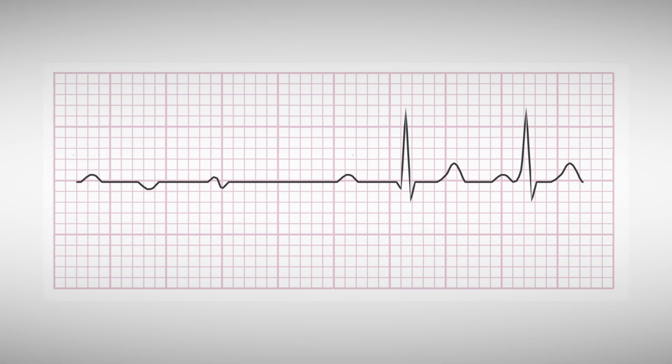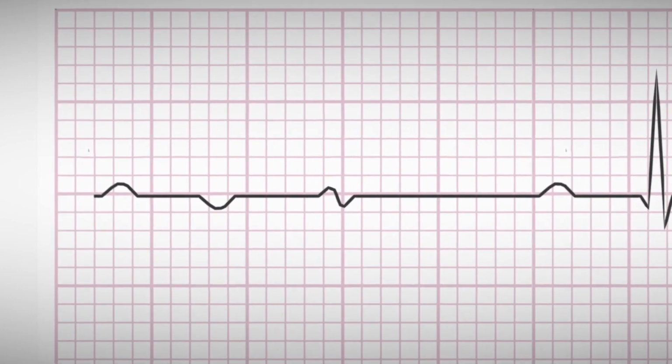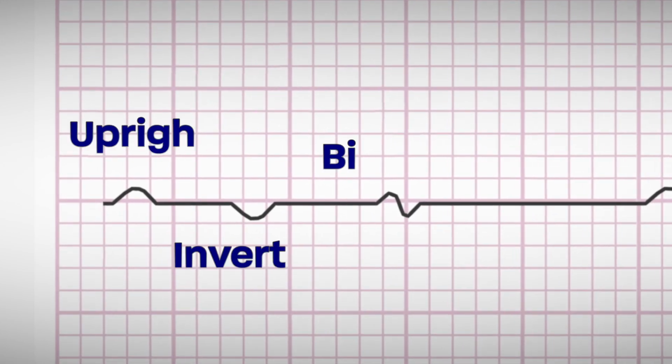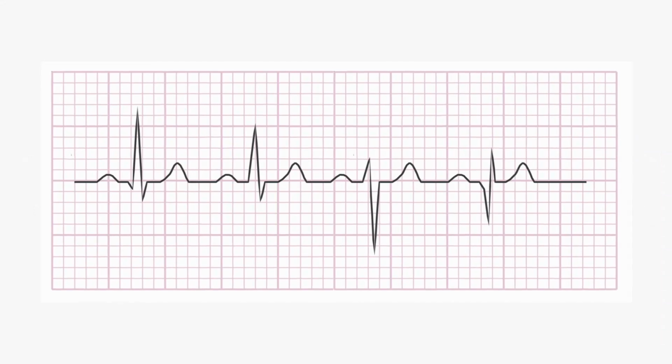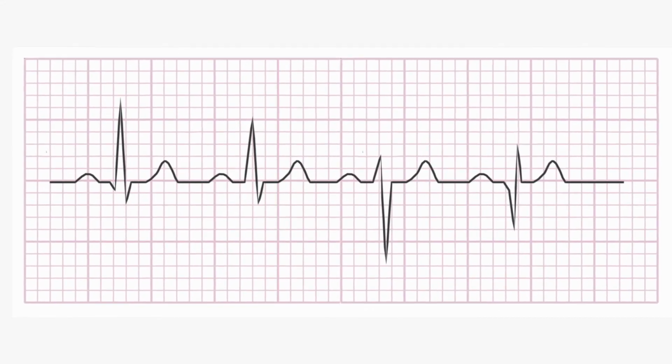Though, it is important to note, as I mentioned just a moment ago, that even though we want them to work together, the two are not directly connected. That is to say, you can have an enlarged P wave without an enlarged QRS complex, or the reverse. The atria and the ventricles are wired together, but they're separate things, and if that wire breaks, they can function separately.